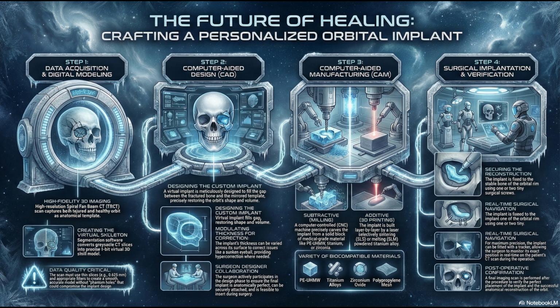Now, imagine a patient with severe panfacial trauma. Finding any reference point that's truly untouched and symmetric, it becomes this incredibly difficult geometric puzzle. But that still requires a clean defect to fill in the first place. It does, but the challenge is bigger than just geometry.